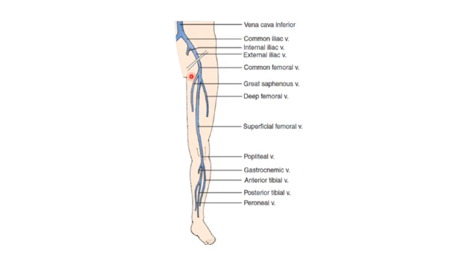What you are interested in is clots at this level, at the common femoral level, and the popliteal vein, and of course anywhere along the course here. You are not really interested in the below knee DVTs, although these are all deep veins. The incidence of pulmonary embolism from these veins is relatively small, that you can ignore it, and the technical challenges of scanning these veins are enormous. It's very difficult to scan below the calf or in the calf.